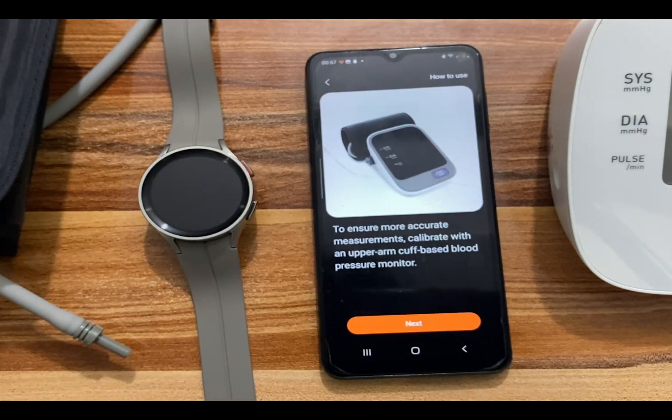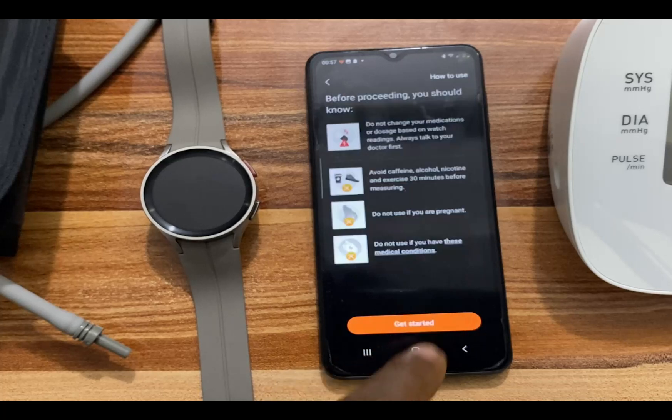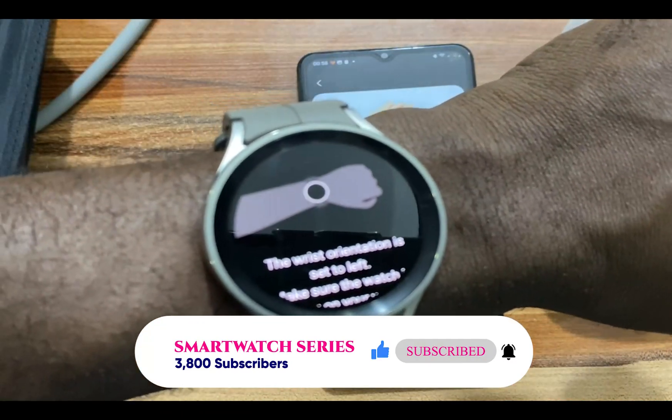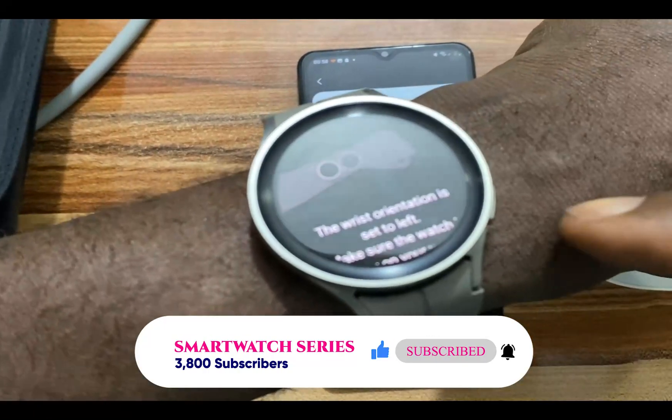Tap on Next to proceed. To ensure more accurate measurements, tap on Next again. Go through each of the warnings, and once you are done, tap on Get Started. Go ahead and wear your Galaxy Watch 5 Pro — it shouldn't be too tight, and you need to leave a little space.